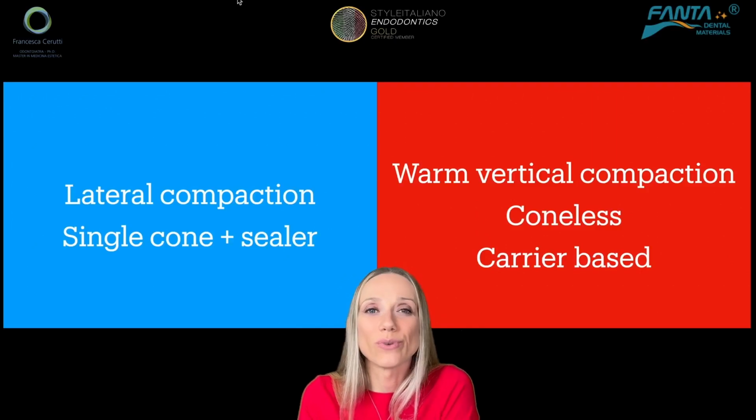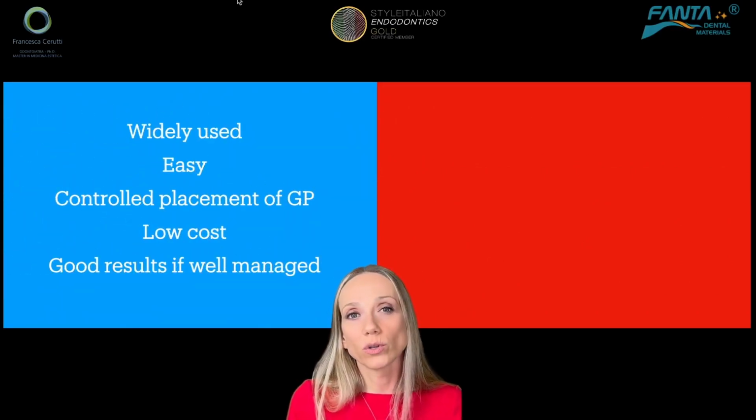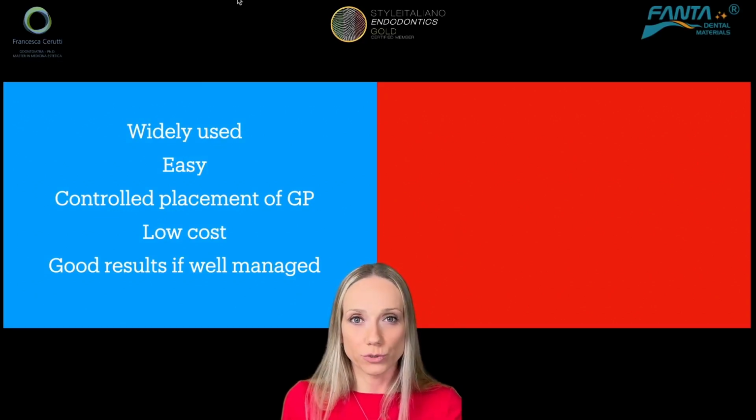What is the difference among these techniques? What are the pros and cons of every type of technique? But what about cold techniques? Why are they so widely used?